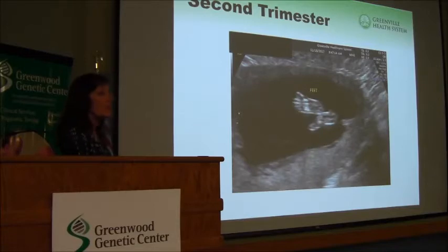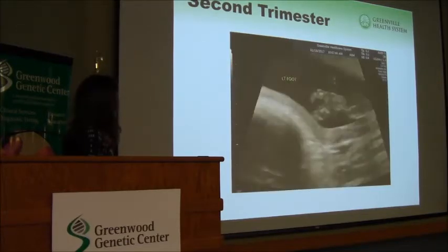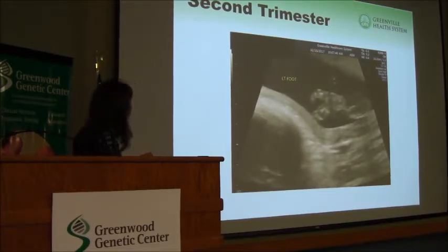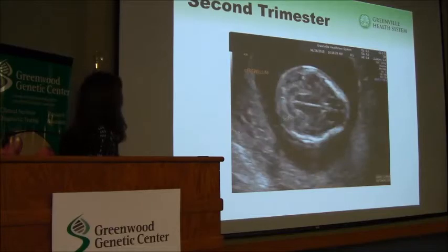Amniotic bands you mentioned. These are both feet, and there's some toes, the upper part missing here, and we see that sometimes with amniotic bands. You mentioned this particular split hand foot. We see that. The reason we knew what this was is because we had a great genetic counselor, might have even been Jennifer, who talked to this family and got the history that this was a common defect in the family, and so we didn't freak out when this was found on ultrasound.